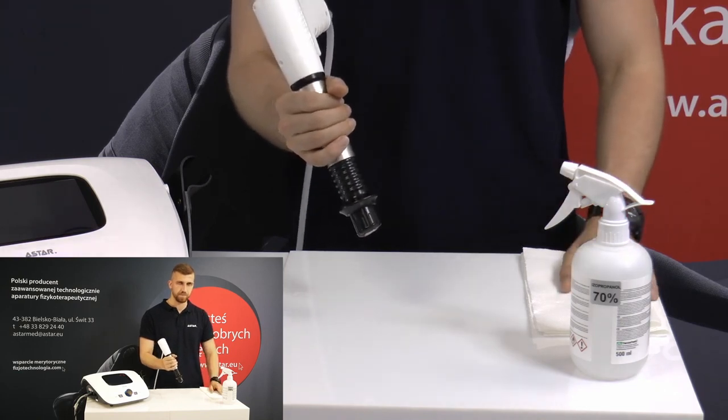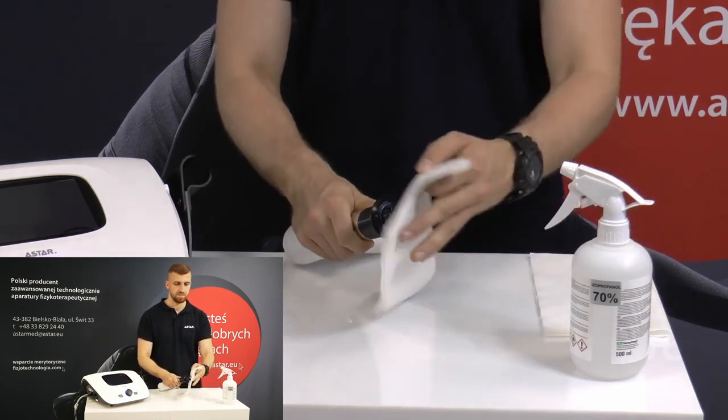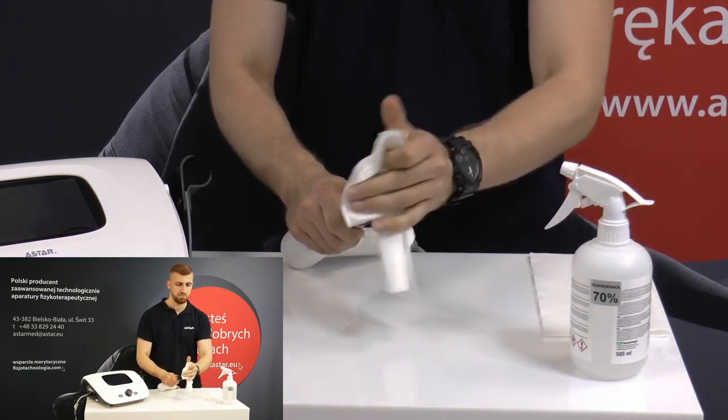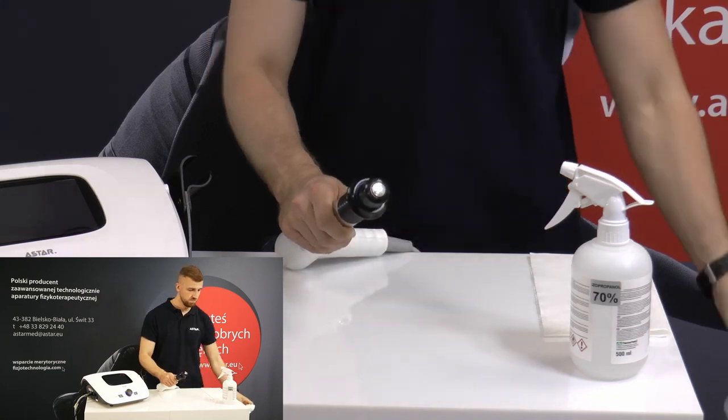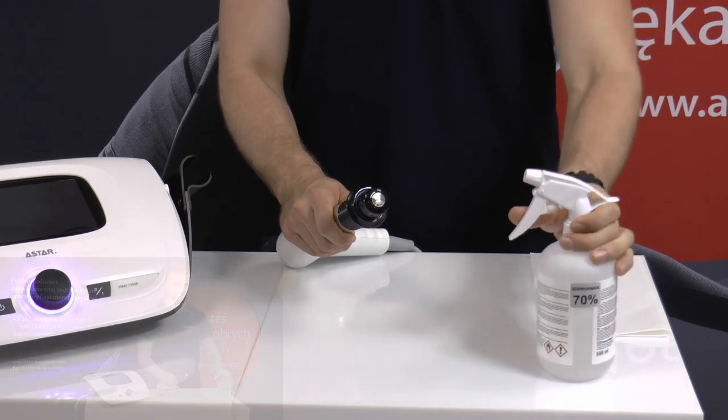After each treatment, remove any gel residue from the surface of the transmitter with a paper towel or a dry cloth and disinfect it with an agent based on a 60 or 70% alcohol solution.